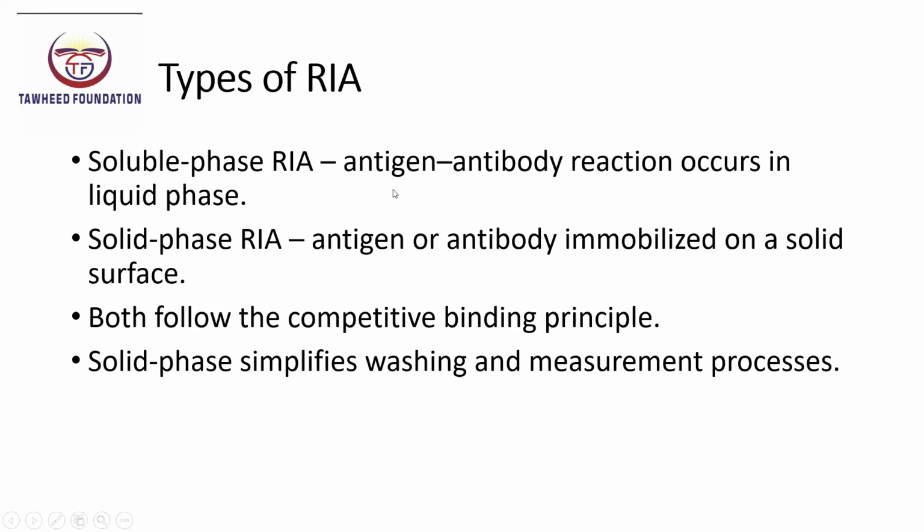Soluble phase RIA: the antigen-antibody reaction takes place entirely in a liquid medium. Both reactants remain in solution throughout the assay. This format was commonly used in the early applications of RIA, particularly in hormone assays.